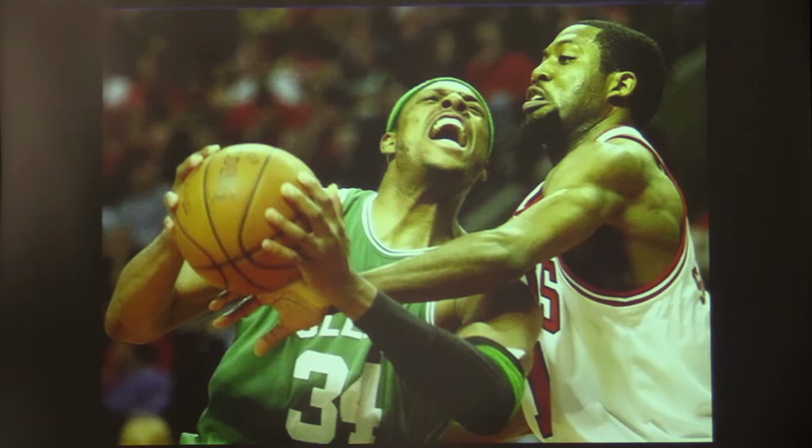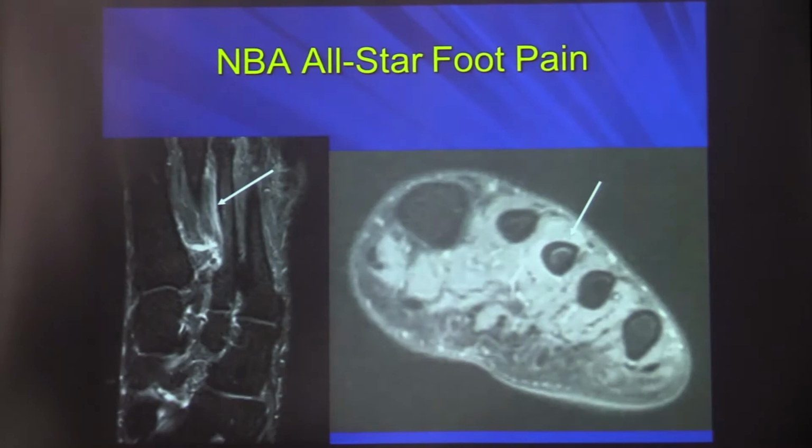Now, at our institution, we take care of the Boston Celtics, and we see a lot of foot injuries in basketball players, a lot of ankle injuries at the ligaments, which I won't be talking about here, but a lot of foot injuries as well. Here's an NBA All-Star with foot pain. And this case highlights for you how sensitive MRI is in the competitive athlete and how it may guide management, or in this case, not guide management. So he presented with foot pain. It wasn't terrible. And he has really very subtle findings.